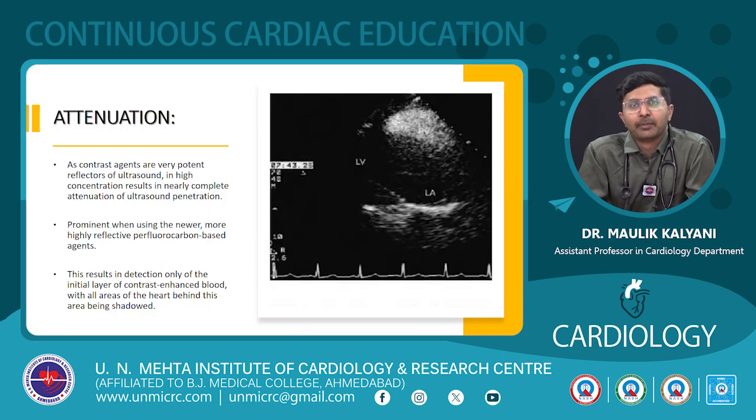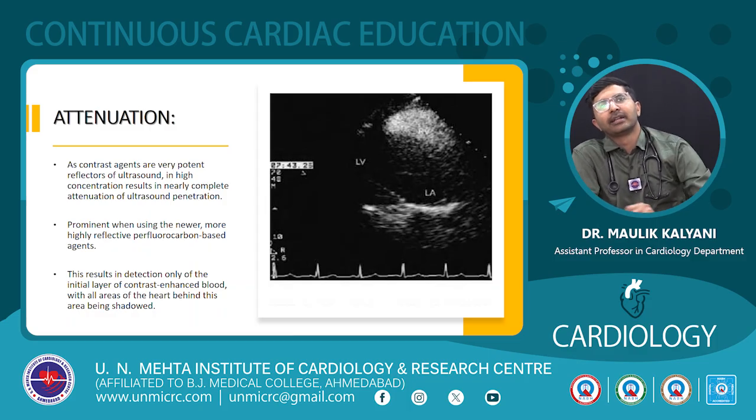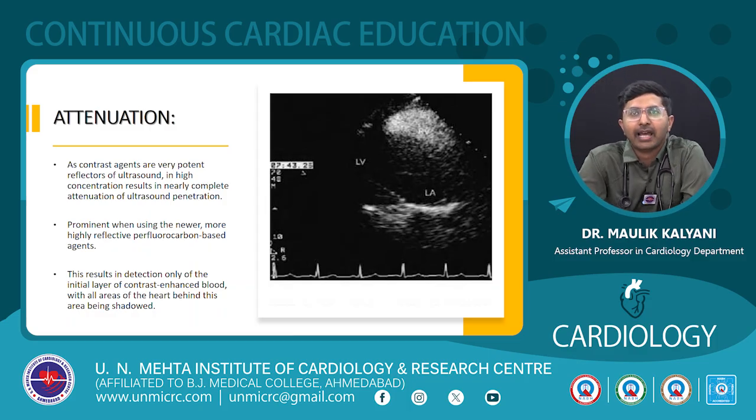Now there are the artifacts. So when we are using contrast agent for this ultrasound, we have to be aware of all the artifacts, because the first is the attenuation artifact. So the contrast agents are very highly reflective of the acoustic energy, so very potent reflectors. So when they are in very high concentration, then it will reflect all the energy and all the beams from the proximal part only. So the distal imaging will show very black and very hypoechoic.